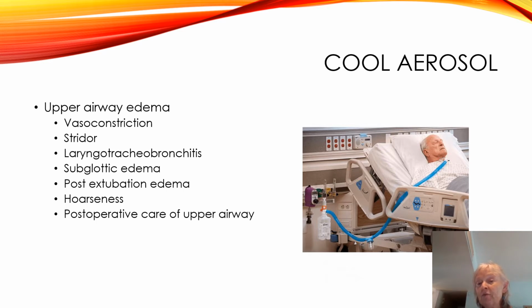In this case, if we're not doing very much with this patient except watching their oxygen, maybe giving them breathing treatments that we'll do with our small volume nebulizers or our MDIs or DPIs, then we can also use this to produce more humidity for this patient to help them cough out their secretions and keep the airway open. This will also help resolve the humidity deficit at this particular point.